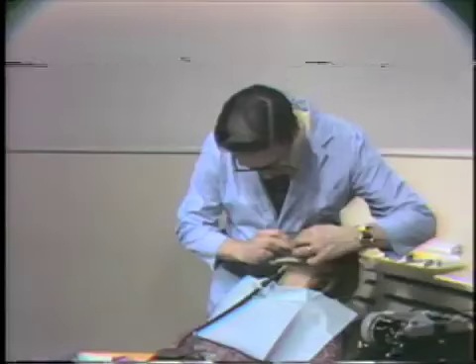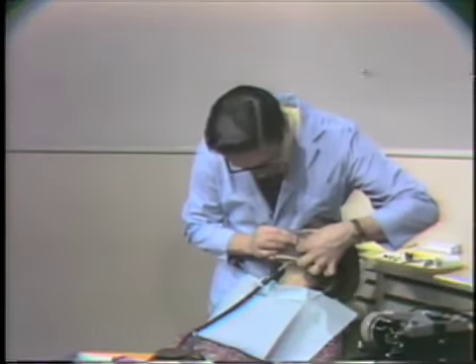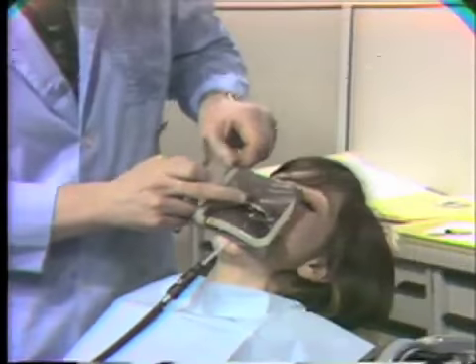You find when you have both the teeth and the rubber dam lubricated like this, it gets quite slippery. Okay, that completes the application of the rubber dam. We have the rubber dam surrounding the 6 anterior teeth, and we have each bicuspid clamped.